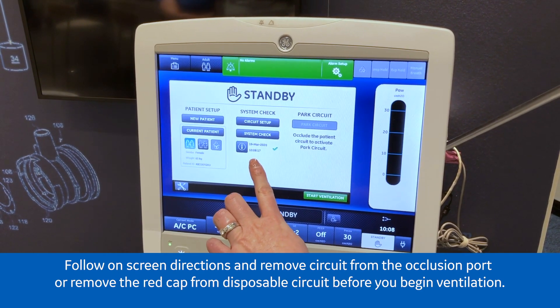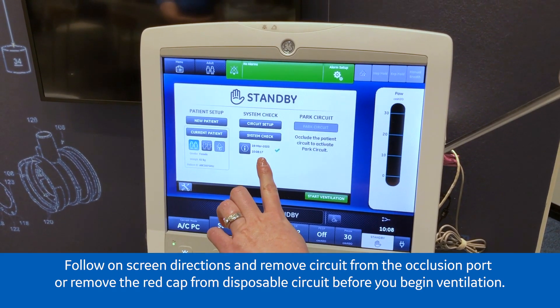A date and time stamp will show on the screen to indicate when the check was last done.